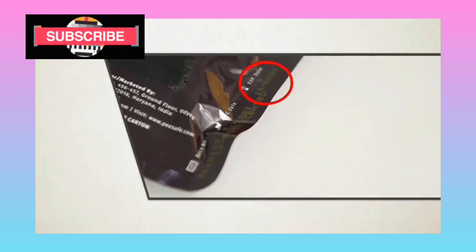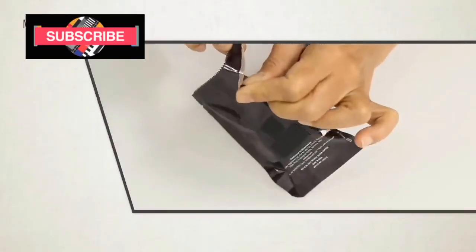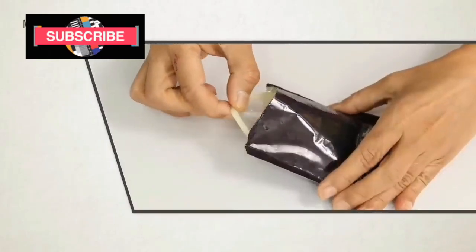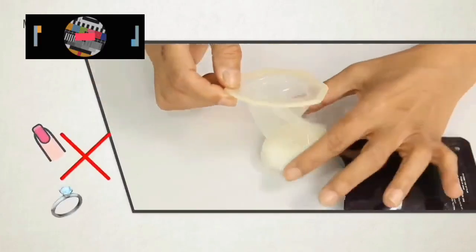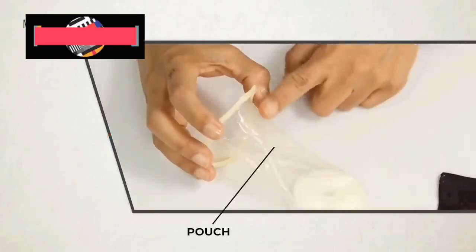How do we use the female condom? First of all, female condoms come in a pack. Check the expiring date. After confirming that it has not expired, then carefully open the pack and bring out the condom. Do not use scissors or sharp nails to open it because it can perforate it without your knowledge, and that can lead to unwanted pregnancy.